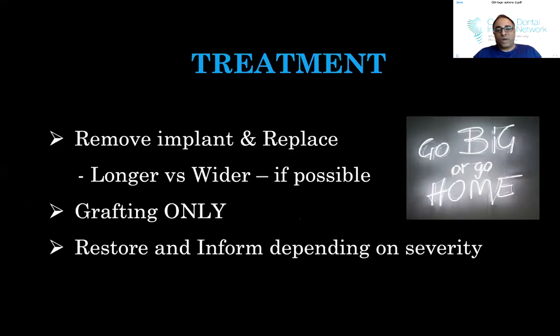In some cases, you may not have every single implant in every single size like I do, so you don't have the stock, and then you just have to walk away from that case, right? Grafted only. Then restore and inform the patient.